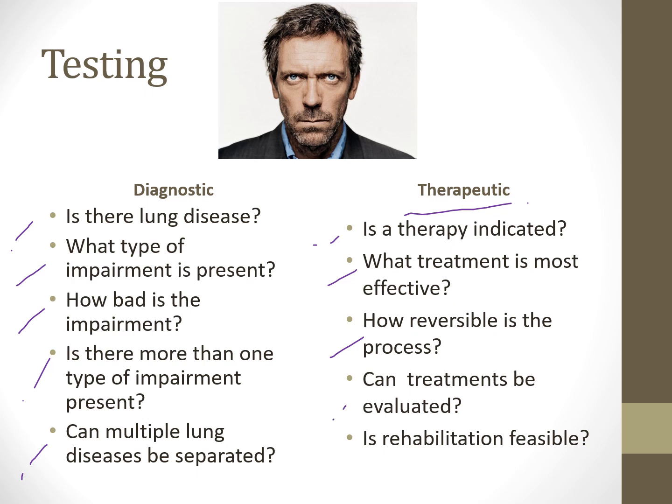Can treatments be evaluated? Can we do something further that's more appropriate? Is pulmonary rehabilitation something that's feasible for this patient? Is it something that they qualify for? So you can see there's a lot of evidence here that not only is it valuable for diagnostic reasons, like an outpatient healthy-ish person that comes into the PFT lab, but also therapeutically, what does it mean for that patient? How can we help them have better activities of daily living, live a better life, live a life more prepared for what's going on in the world around them, and not have to be scared of their shortness of breath that they get here and there? So we can be a part of that.